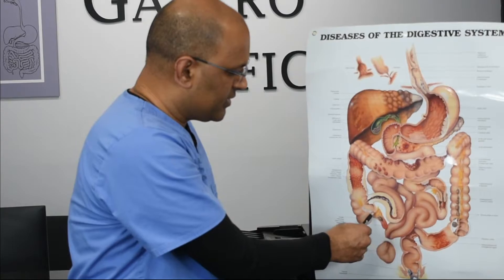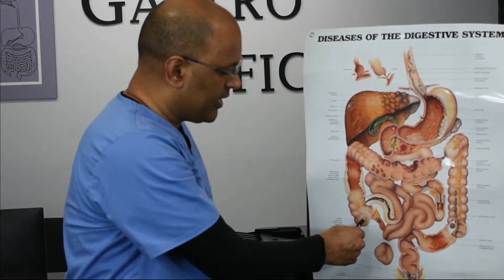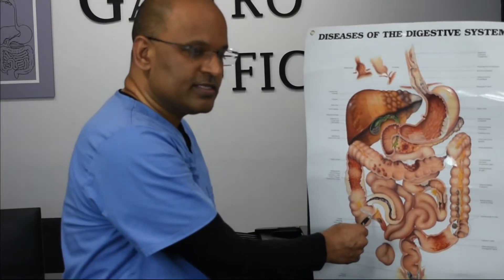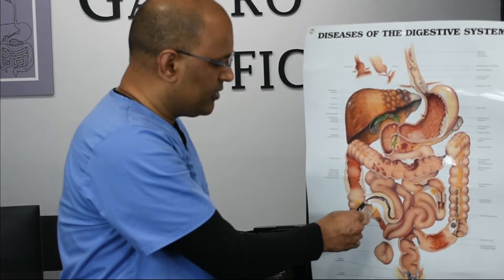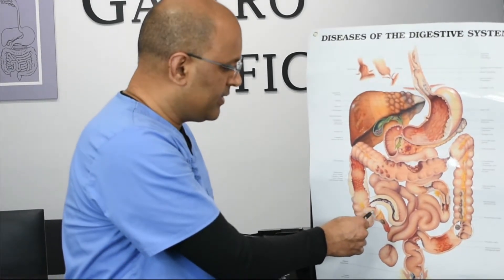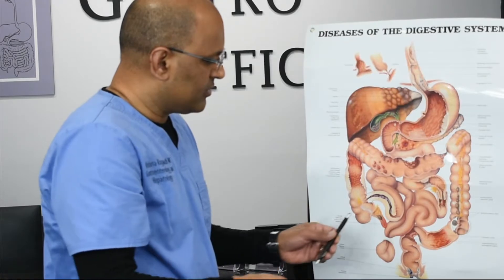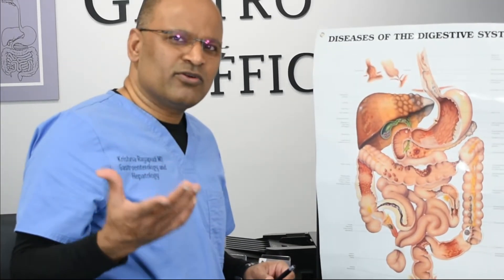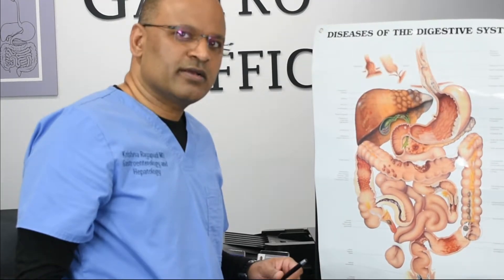We reach something called the cecum. You can see the appendix and the appendiceal orifice from inside, which marks the cecum. You can also see the ileocecal valve from inside, which is also visible when you're in the cecum. So what do we look for when we do this colonoscopy?